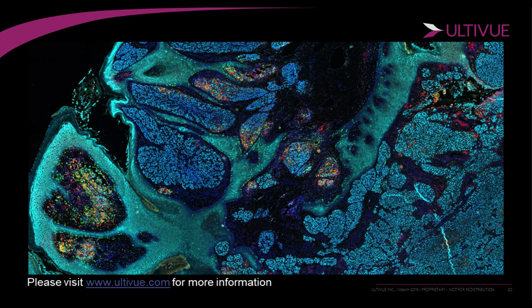I believe Zeiss has two different configurations. We've run with the Spectra X, which was their predecessor system that they had used to make their Axioscans Cy7 capable. But they've recently developed a Colibri upgrade that they really own, that is available on their new commercial systems. And I believe they can upgrade systems that are already out in the field to be able to do the Cy7. So that's a simple light source upgrade.